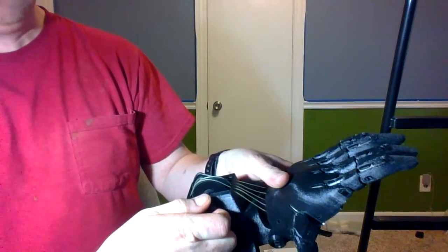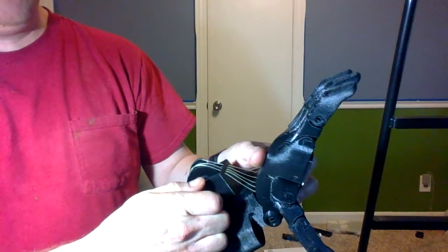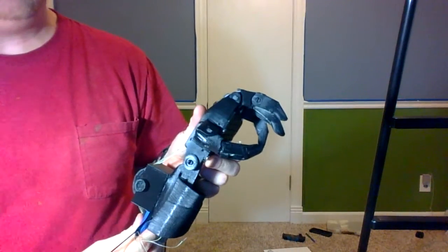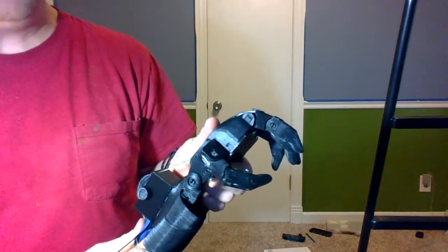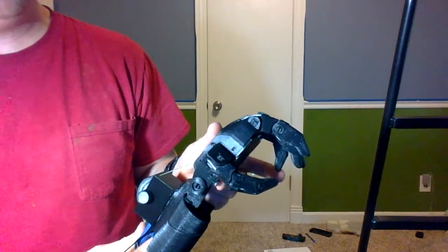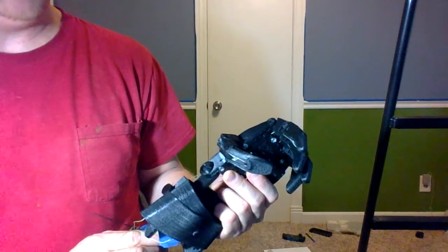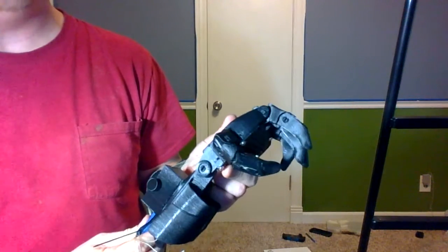The next position would be what I call a cup holding position, where the little finger comes in farther to hold the bottom of a cup, and then the top three fingers would wrap around the cup.